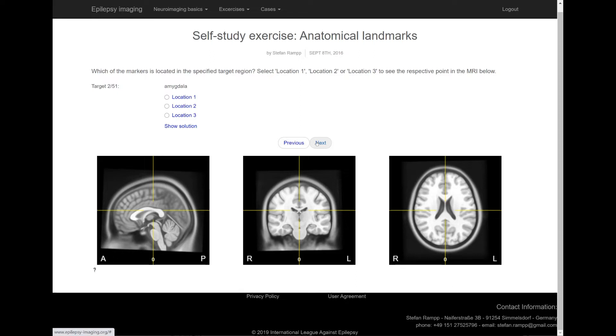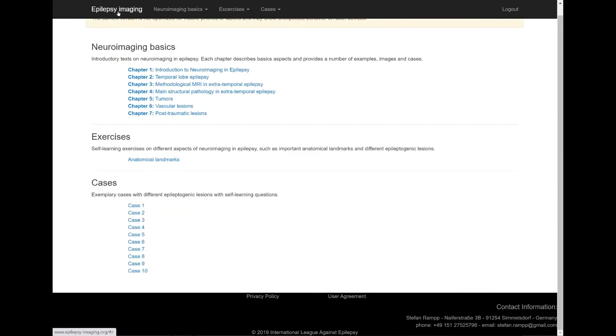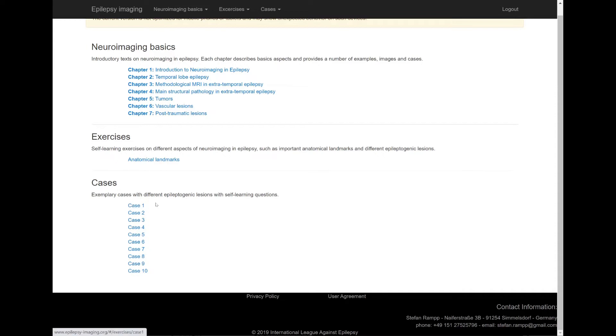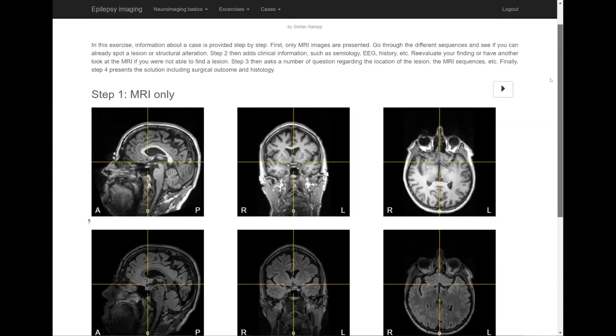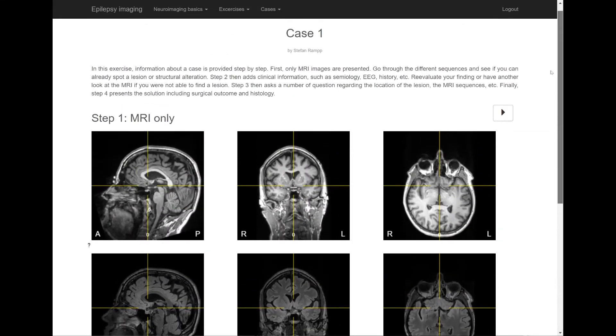Let's go back to the main page. The Cases section contains several real-world cases to practice interpretation of MRI in the context of other clinical findings. First, you are presented only with a selection of MRIs. In this step, you review the imaging data without any additional information.